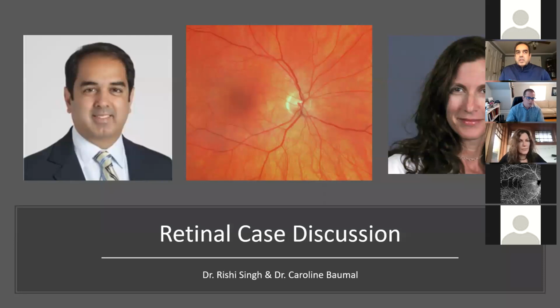Yeah, I think we've learned from all of these studies that I just presented how little or a lot this really matters. And I think that we look at these OCTs day in and day out, and if you ask a lot of retina specialists, some look at the cube, some look at the raster scans, some look at just the maps. And so you try to present the most coherent way of looking at these. I think ultimately the software will develop further, where it actually measures those volumes for you, because I think that's what we want to get out of this. Ultimately, if the machine spit out IRF is now 0 and SRF is present, we probably could be better even about decision making we even can do now.